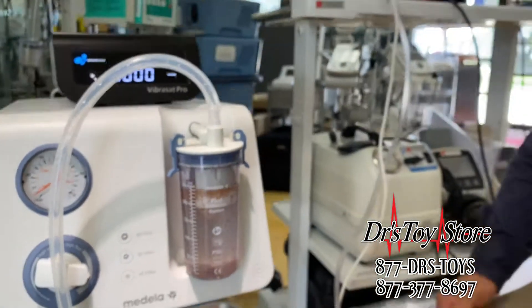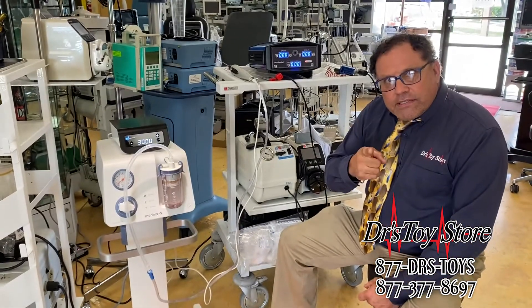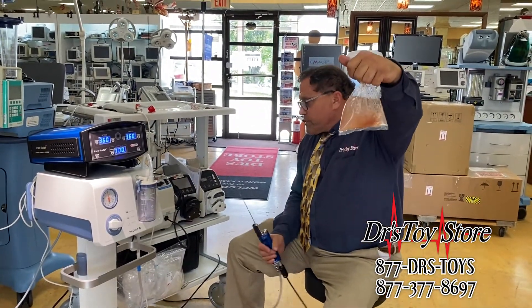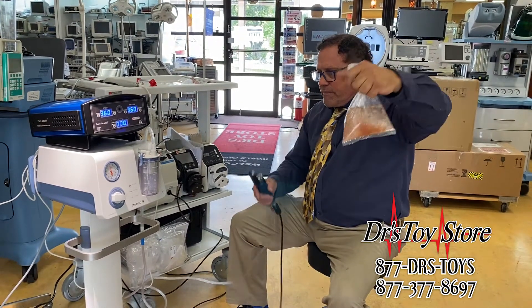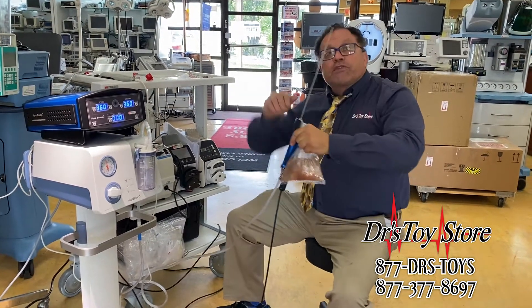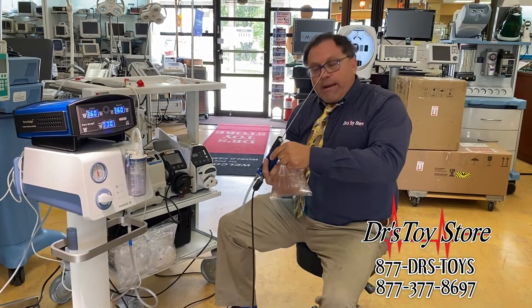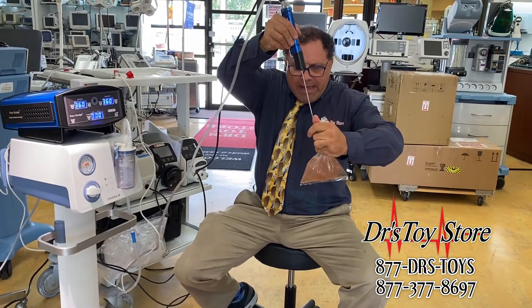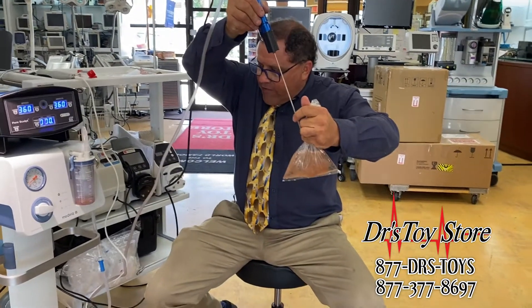Here's the brine shrimp. We're gonna try the Pure Sculpt — three-millimeter cannula, same suction, same level. Here we go. This is rotational back and forth, not an in-and-out jackhammer. Here we go — perforated the bag and we're at work, we're moving, filling up.